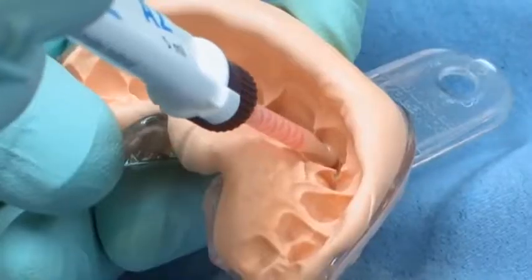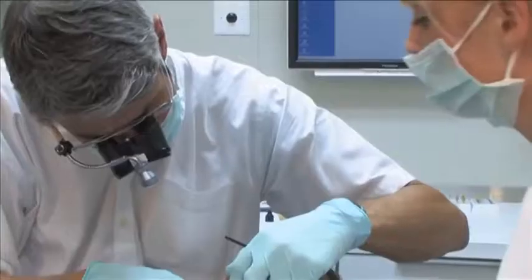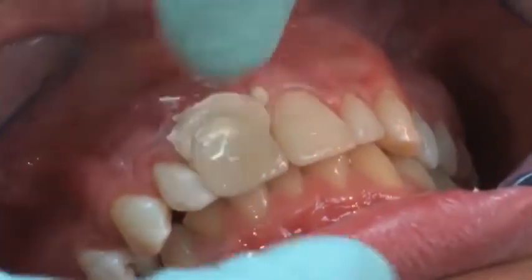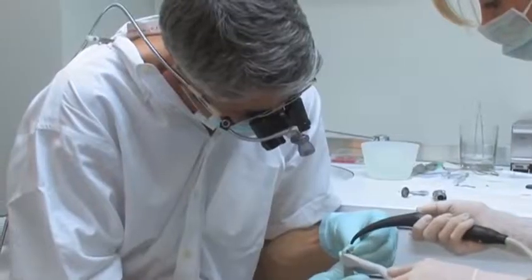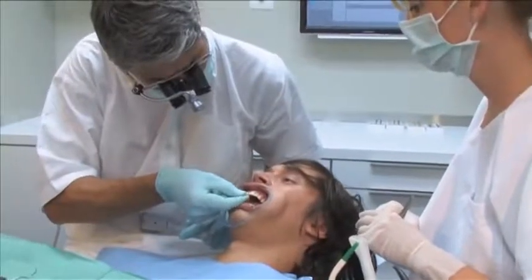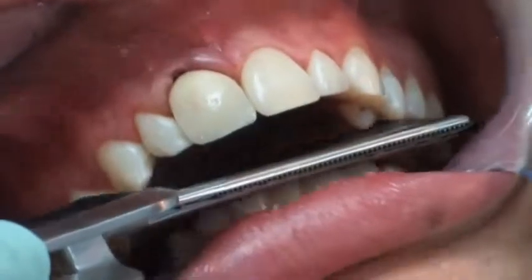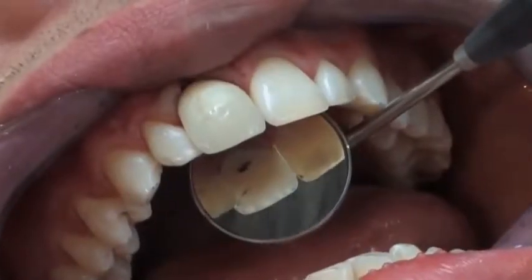After isolation of the preparation with Vaseline, the provisional restoration is fabricated using Cool-Temp Natural. The material reaches an elastic consistency after a short duration of time in the mouth and can be easily removed from the mouth together with the preliminary impression. The unfinished provisional restoration is positioned again onto the preparation to check its fit. The inhibition layer is removed using alcohol. Excess material is removed afterwards using rotary instrumentation. The occlusion is checked and all unnecessary contact points are removed completely.